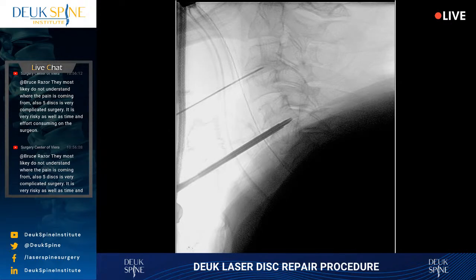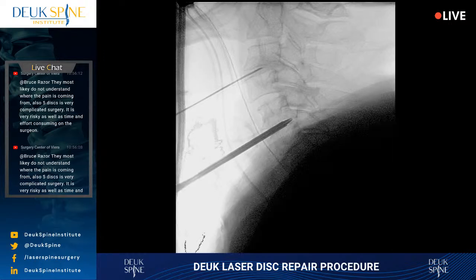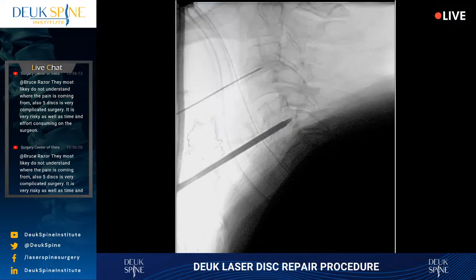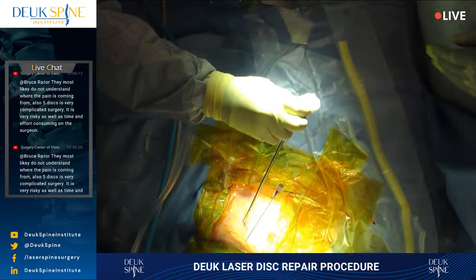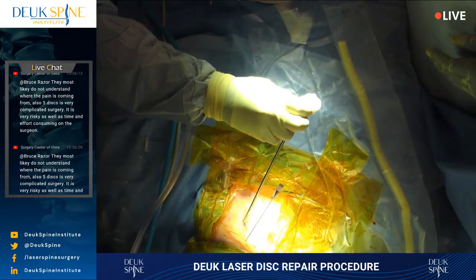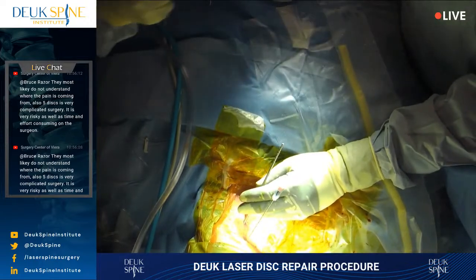That's the one thing artificial disc can't do. Artificial disc can't take no movement and give it back to you. But this procedure can. And the reason is we're releasing the scar tissue inside the disc, breaking up the inflammatory tissue. Shot. So it's pretty remarkable what can actually be done endoscopically with the Deuk laser disc repair by doing the annular debridement. A lot of the scarring happens at the level of the annulus.